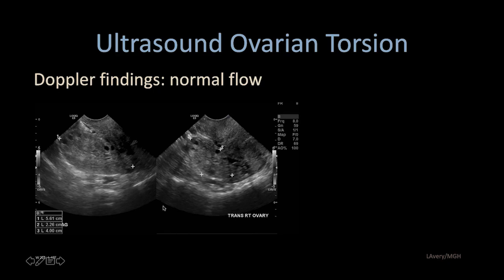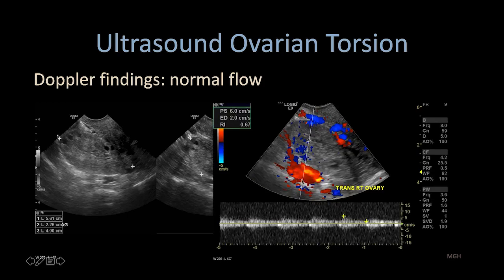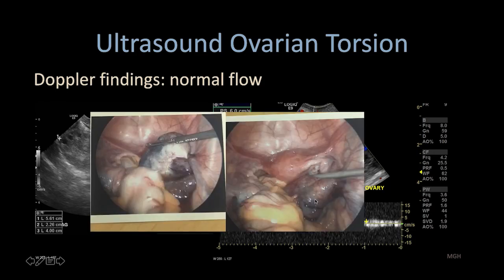At times there can actually be normal flow on a torsed ovary because of that dual blood supply. Here's an enlarged ovary measuring 5.6 centimeters with multiple tiny peripheral follicles and heterogeneous central stroma. A normal low-resistant waveform was seen on the ovary, but at laparoscopic evaluation, this ischemic ovary was visualized. So the findings on grayscale helped us determine that this is, indeed, a torsion ovary.